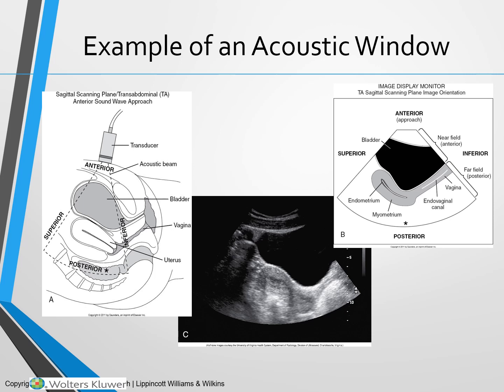Filling the urinary bladder may be part of a patient's prep, depending on the type of exam that you're doing, in order to create this good acoustic window for your ultrasound scan.